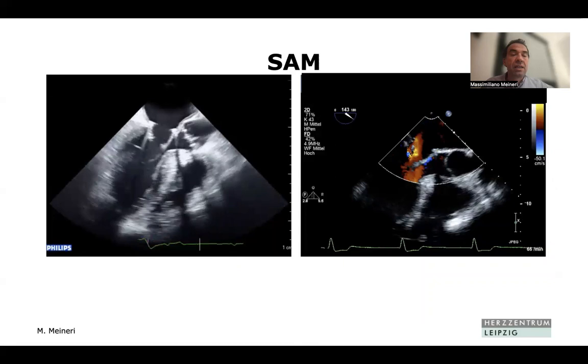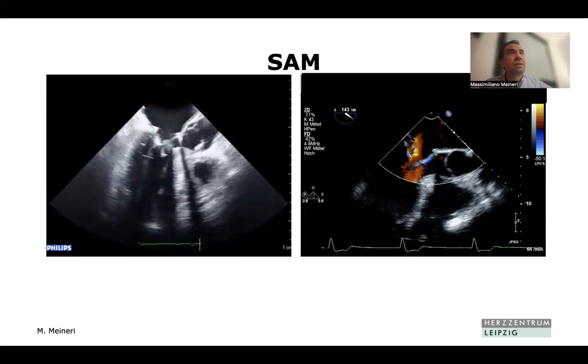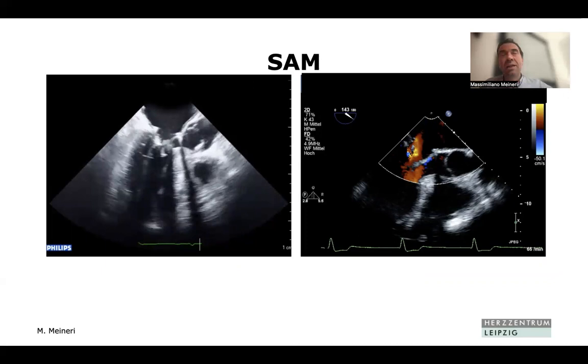SAM is a problem after mitral valve repair. The solution is not simply giving volume and a beta blocker and ignoring it — there should be no SAM. We had a case where after significant SAM, surgeon Michael Borger went back on pump, removed the ring and replaced it with a bigger one. The valve remained competent and the SAM resolved. If you use a smaller ring and have SAM, consider whether the valve can tolerate a bigger ring.